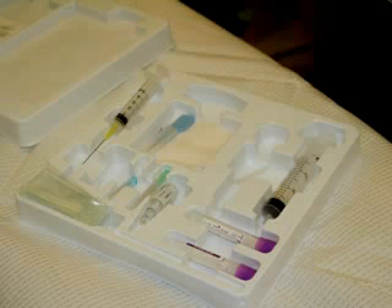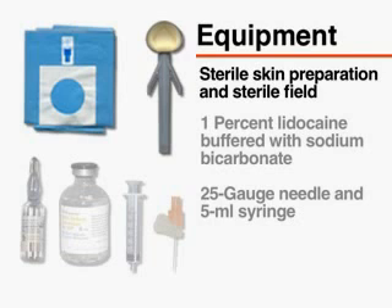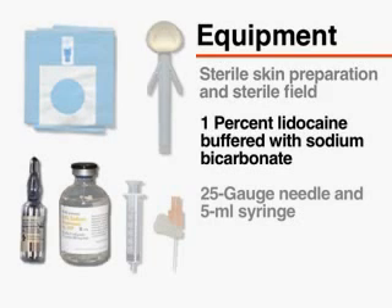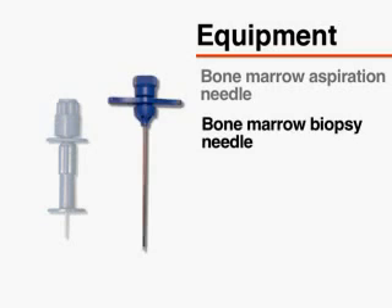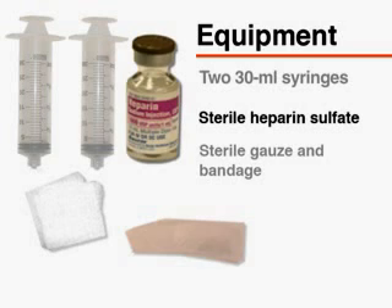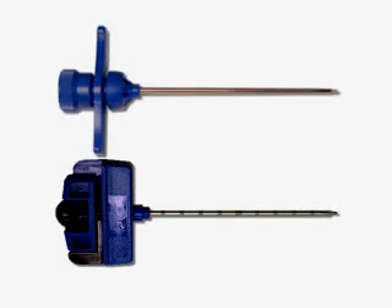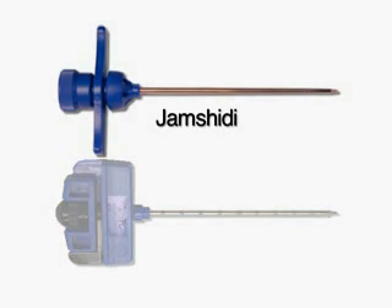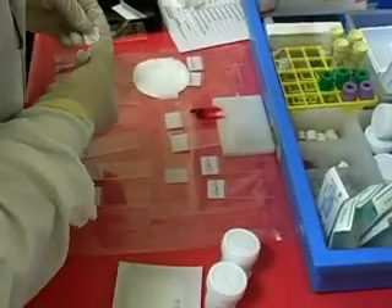Gather the necessary equipment prior to performing the procedure. You will require equipment for sterile skin preparation and a sterile field, 1% lidocaine buffered with sterile sodium bicarbonate, a 25-gauge needle and 5-milliliter syringe, a bone marrow aspiration needle, a bone marrow biopsy needle, two 30-milliliter syringes, sterile heparin sulfate, sterile gauze, and bandage. Several types of bone marrow biopsy needles are commercially available; this video will demonstrate the use of the Jamshidi needle for obtaining a core biopsy. There should be an additional team member present responsible for immediate preparation of specimens.